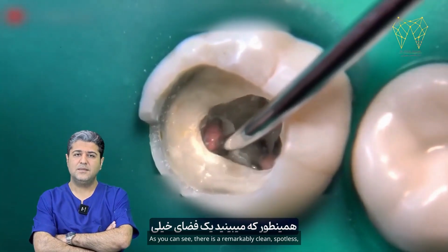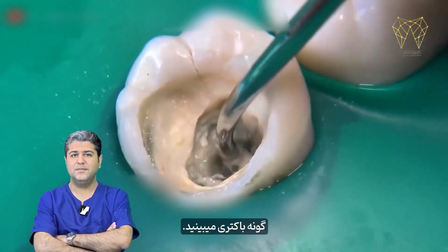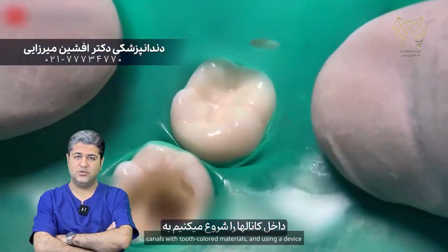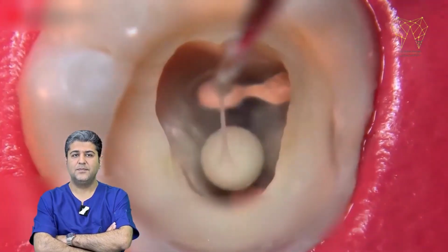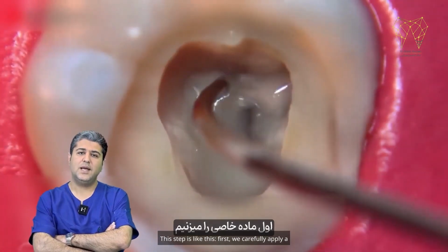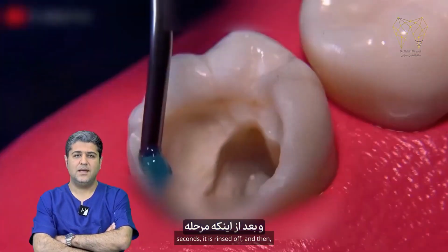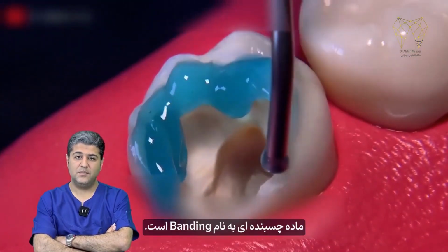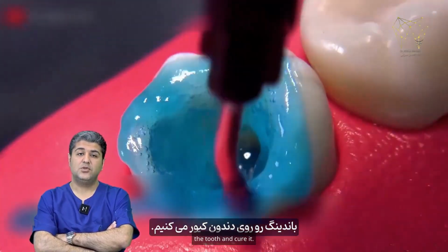As you can see, there is a remarkably clean, spotless, and completely bacteria-free space here. As you can see, we start filling the inside of the canals with tooth-colored materials and using a device called a light cure. This step is like this. First, we carefully apply a special material onto the tooth enamel, and after 10 seconds, it is rinsed off. And then the next step is to apply an adhesive material called bonding.